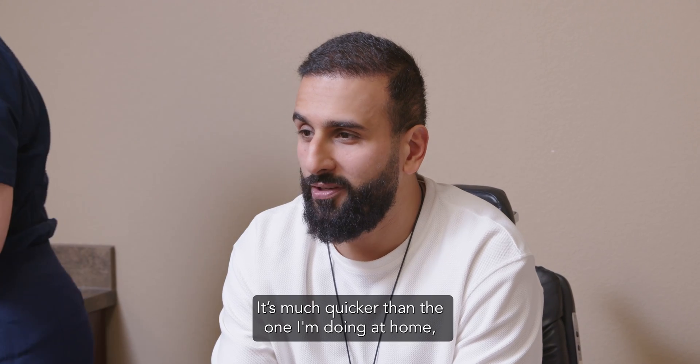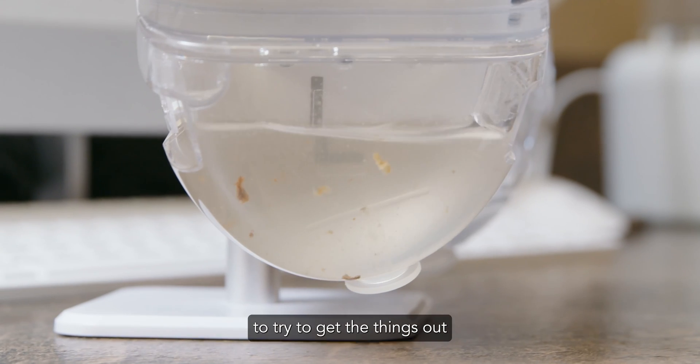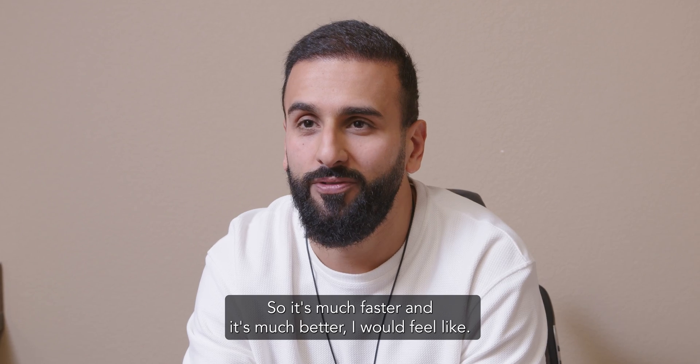It's much quicker than what I was doing at home. At home, I was going to spend like 15 to 20 minutes trying to get the things out and not hurt my ears, you know? So it's much faster and it's much better, I would feel like.